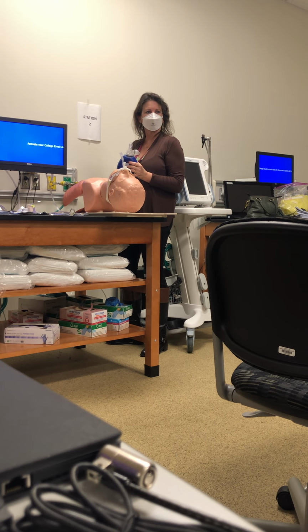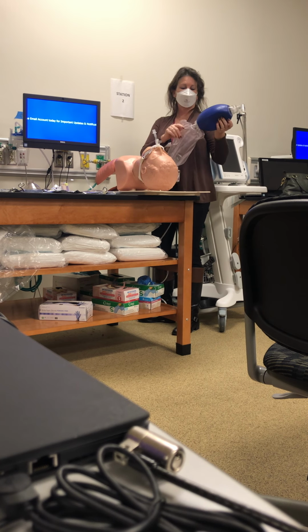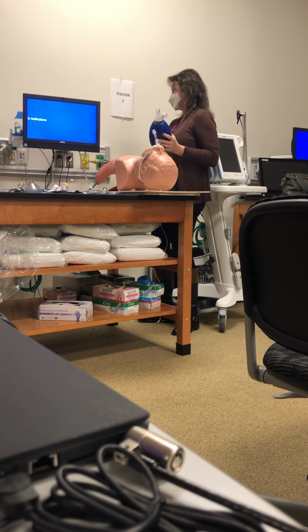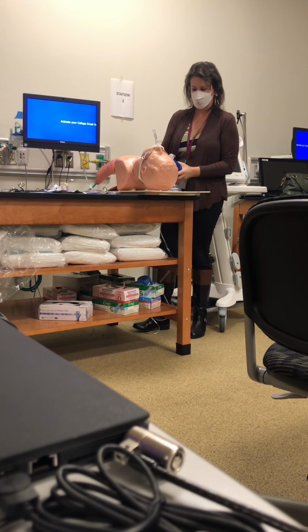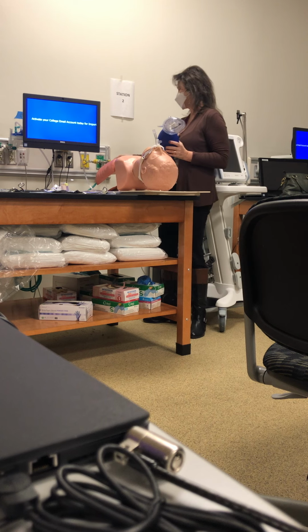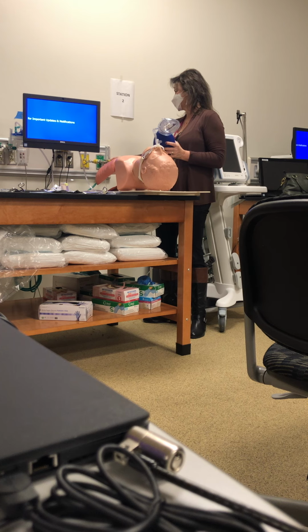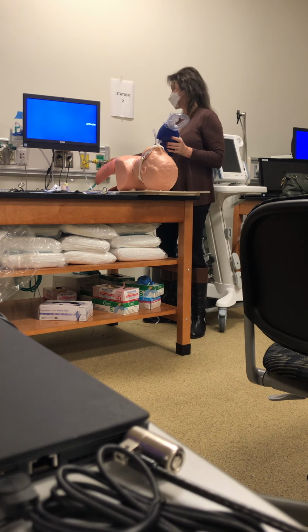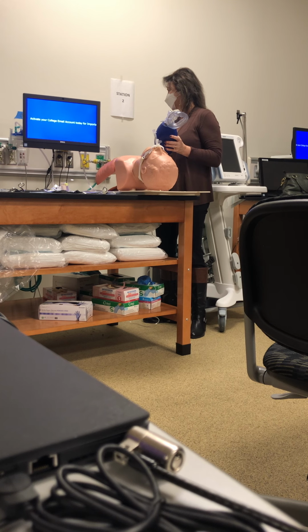I mean, you can go 15 or low flush if you need to. Does everybody know what a low flush is? No? So normally if I'm getting ready to intubate a patient or bag a patient, I'm turning it up to 15, okay? If I start to ventilate the patient and their SATs are not coming up, all right, then I can go to a low flush. I can go higher. Listen to this low flush. Hear that low flush? This is a high flush. Hear that? You don't need to be at a high flush, but you can be at a low flush. So you're going to start at 15.